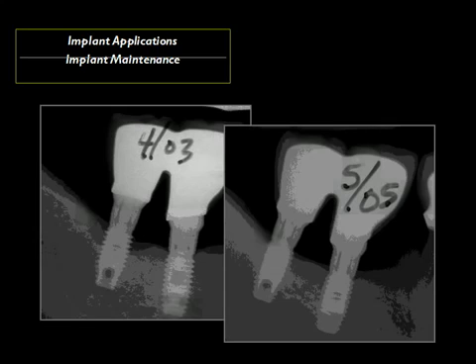The resultant situation is this, that we were able to regrow the bone through precision equilibration. We were able to take the environment from a 4-thread loss, only doing precision equilibration, allowing that bone to regrow.